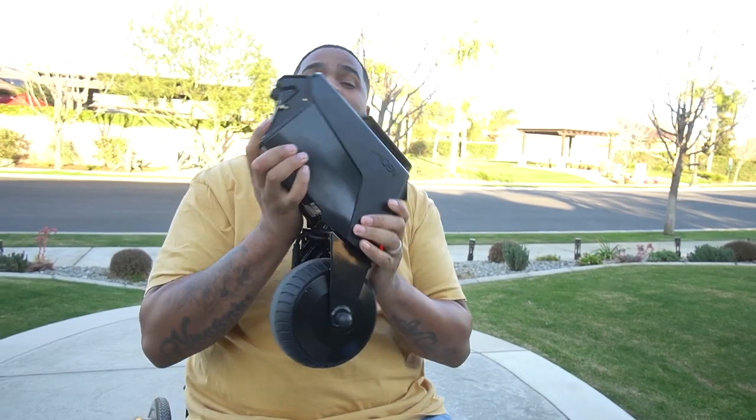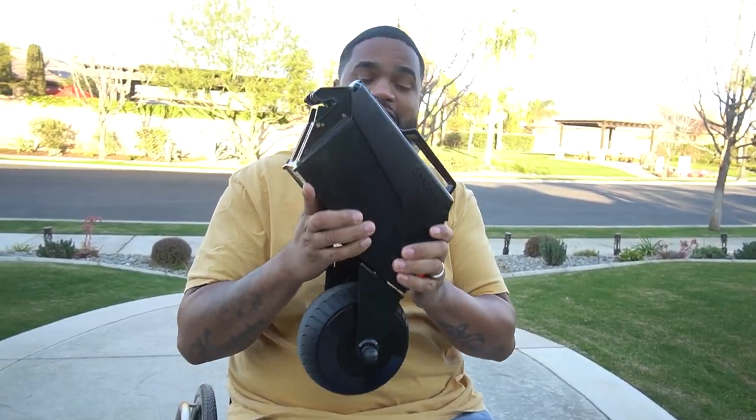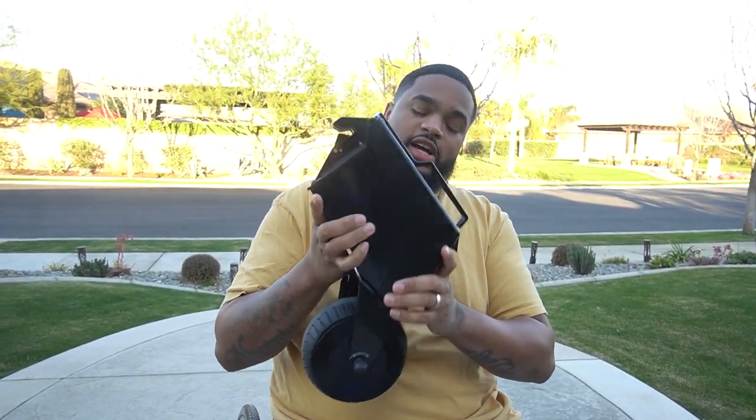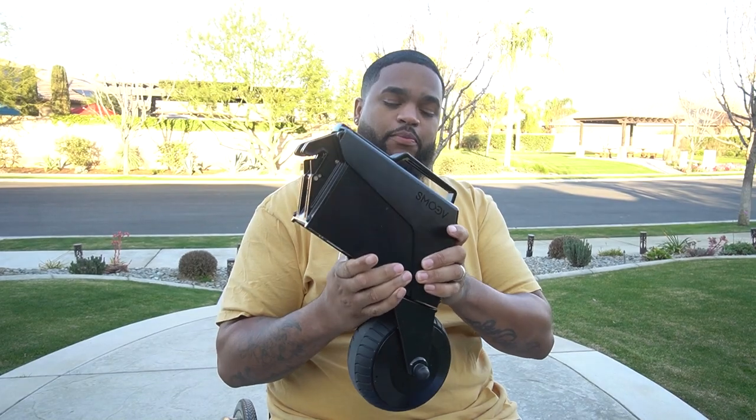What's up, you guys. Welcome back to the channel. Here we talk about anything and everything wheelchair-related. Today we're going to be testing out this new product that I just got my hands on. It's called the Smoov One. I know I told you guys last video we're going to be testing this out. Well, here it is. Recently I've been having a lot of shoulder problems, so I needed a little bit of help, and that's where the Smoov One comes into play.